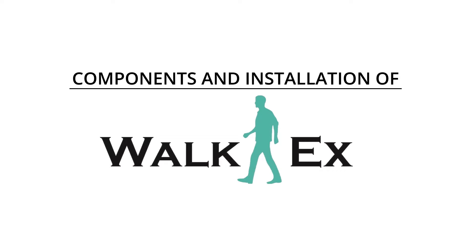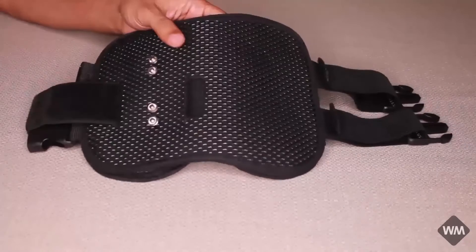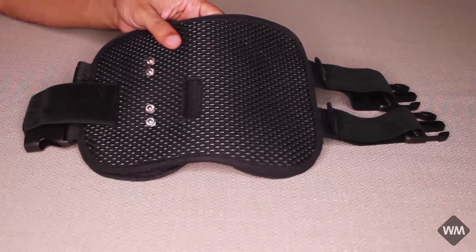This video explains the components of the WalkEx and the installation process. This is the wearable cuff on which the WalkEx controller is put on.